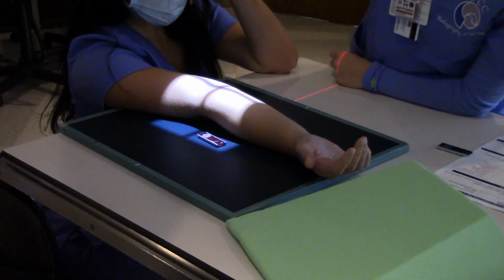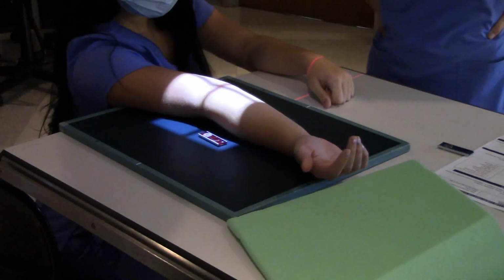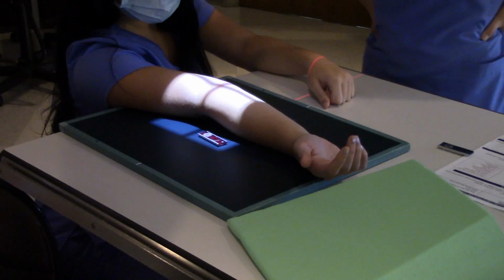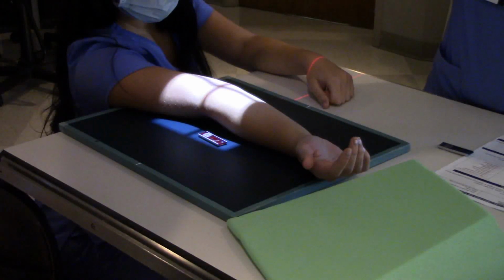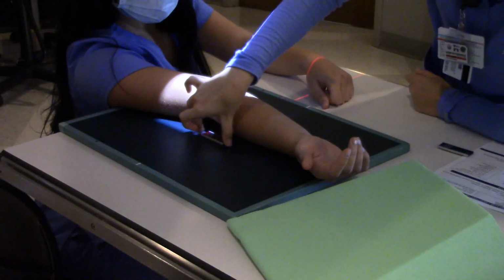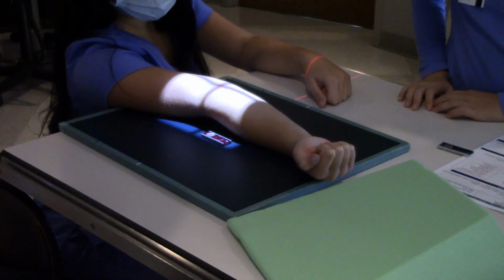And sometimes there's just bruising, you know, because somebody will hyperextend their elbow or twist it or something like that. And so the bone's intact, but there's a lot of soft tissue damage. All right, you can cone down a little side to side. Just make sure you don't clip off your marker. Cone down. My teacher used to say cone down to skin line. Okay, there you go. That'll work. Elbow x-ray. Goes right through the joint.